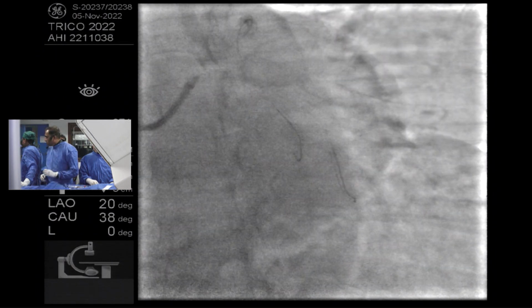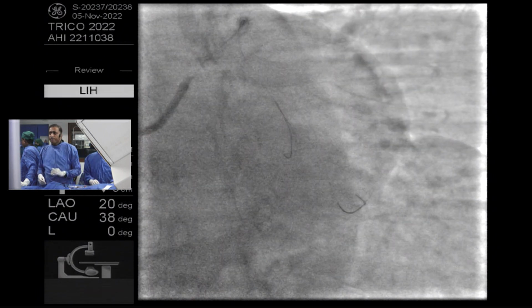And thinking ahead, Dr. Saito, so when you've done both the OMs, you'll do a provisional of the left main, and then jail the wire, and then maybe kissing? Yeah, of course. And before doing kissing, I want to do the POT technique. POT before kissing. Yeah.